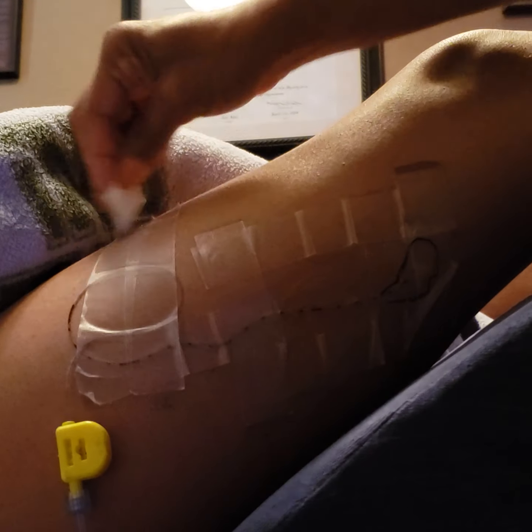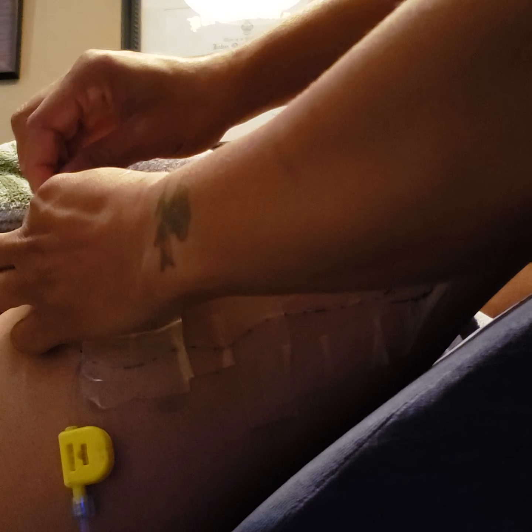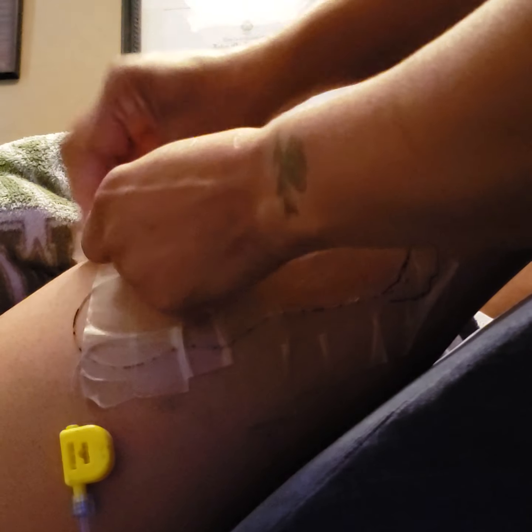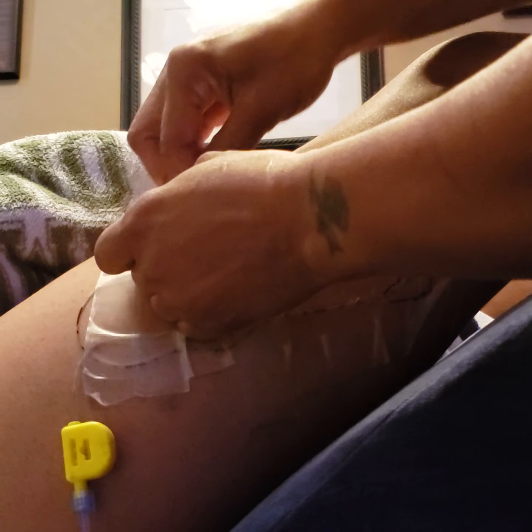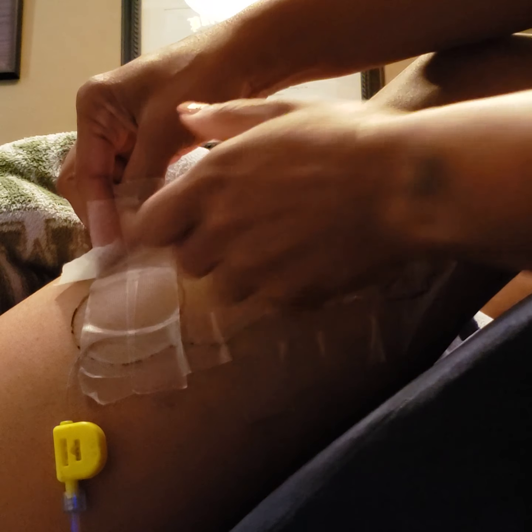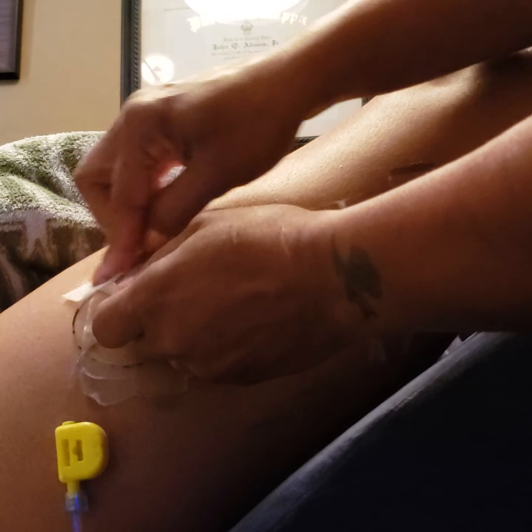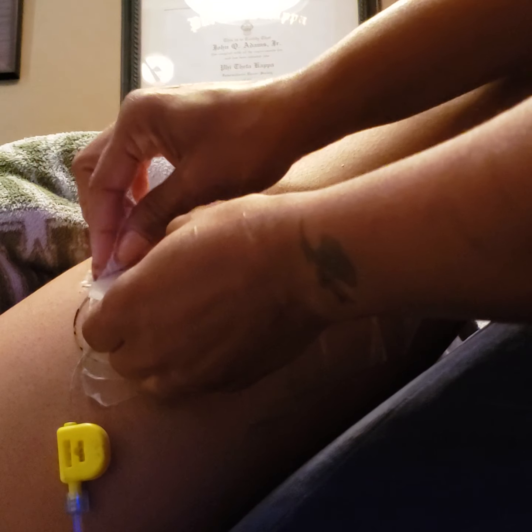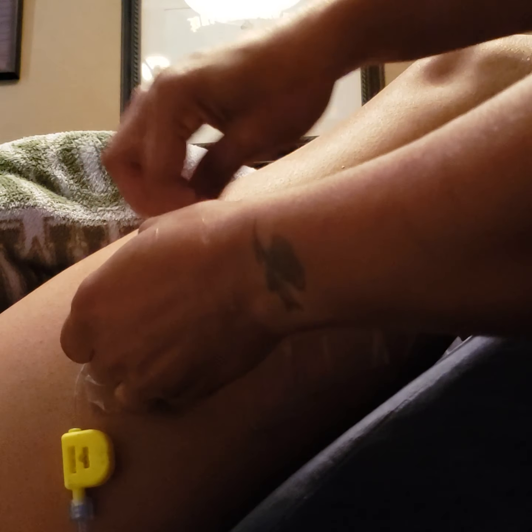You just rub it, you can lift it a little bit and just rub. When you're removing the catheter, wherever the surgery site is — if it's the leg — you want to pull this downward. If it was in the arm or somewhere in the upper extremities, then you will pull up. They have a lot of tape on here.